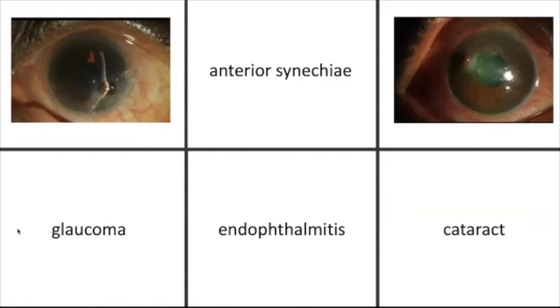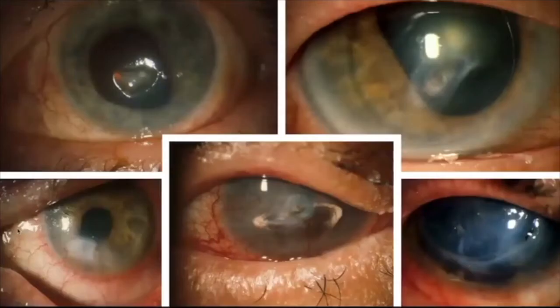Just to highlight which patients you want to know about: if the patient has a leakage but the anterior chamber is stable, or is stable after applying a therapeutic contact lens, that is a patient that does not need glue. It may be helpful to use a contact lens alone, or a contact lens plus a dry amniotic membrane that you still have on the shelf. You can shape the amniotic membrane as you want, or make it a little bit larger, it doesn't matter. The point is that you put a bandage contact lens, and better if with the dry amniotic membrane.